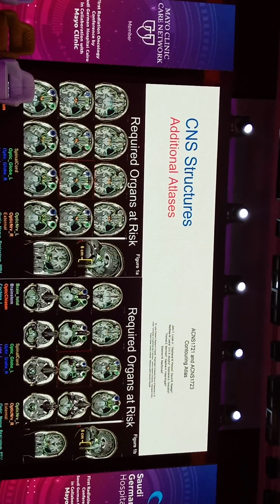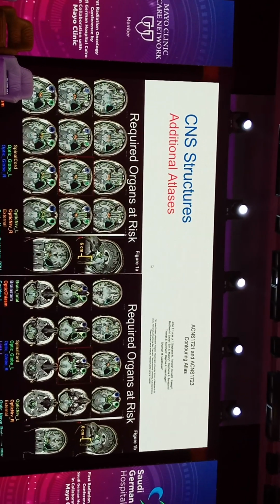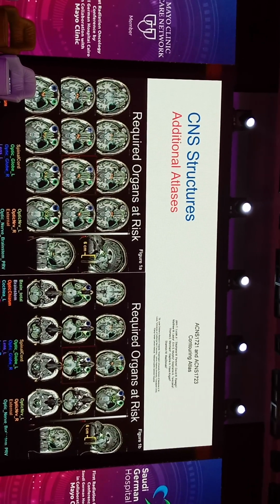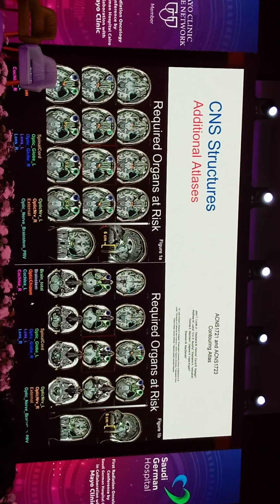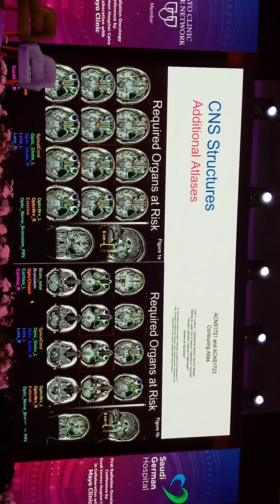But this is only one atlas, and other clinical trials have their own atlases. And what's more is they may define the structures to be contoured as different from what another working group or another consensus guideline recommends. And this can lead to differences when comparing across trials.